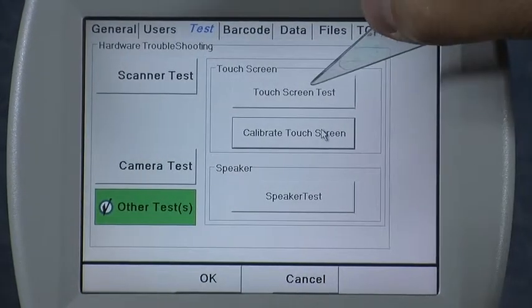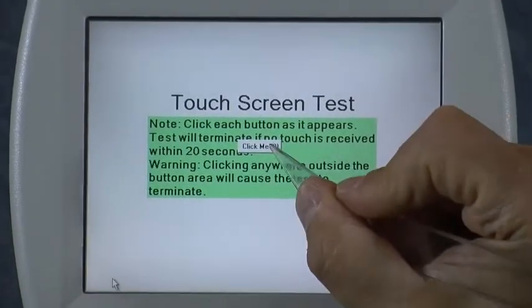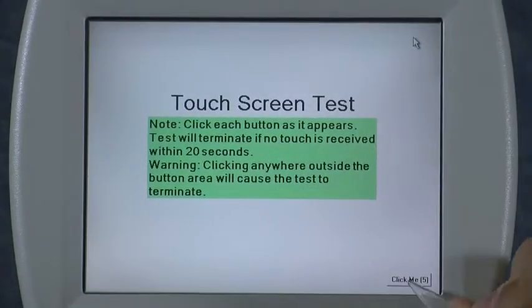Then if you want to test it afterwards, you can press the Touch Screen Test menu and click the five buttons on the screen to verify that it's touching in the right spot.